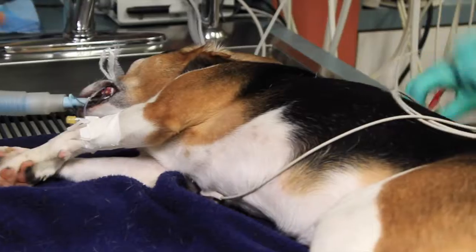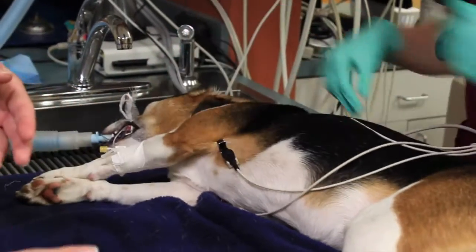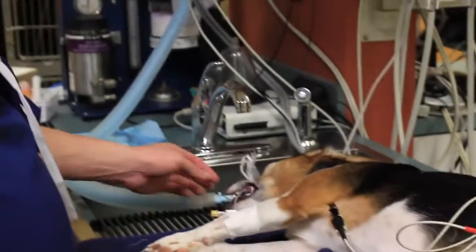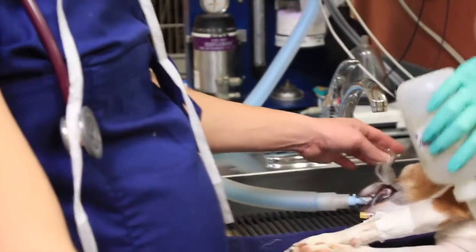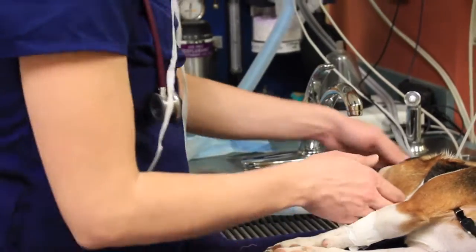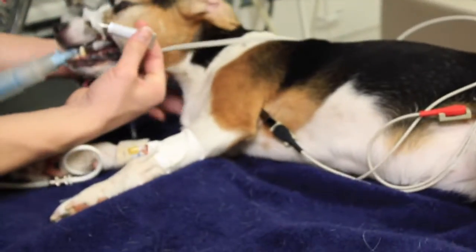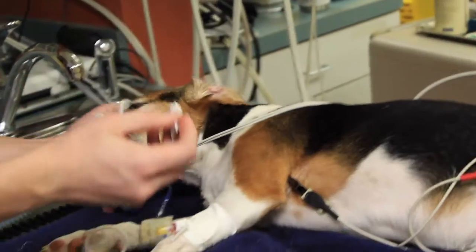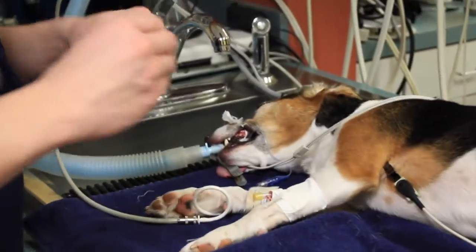Brenna's getting her hooked up to the monitoring equipment. Throughout the procedure we'll be monitoring her heart rate, her respiratory rate, her oxygen saturation, and her temperature, as well as checking her anesthetic depth with jaw tone and her eye reflexes. This is a blood pressure cuff that monitors blood pressure throughout the procedure. We also lubricate the eyes since they can't blink on their own — it helps protect the cornea.